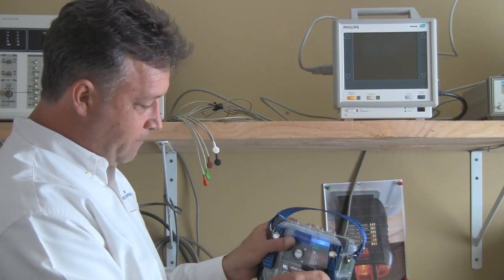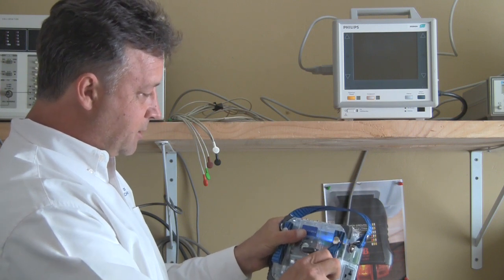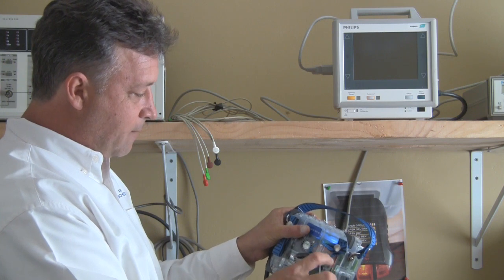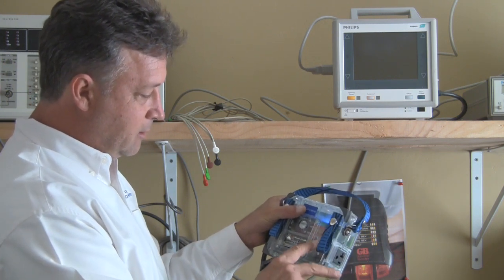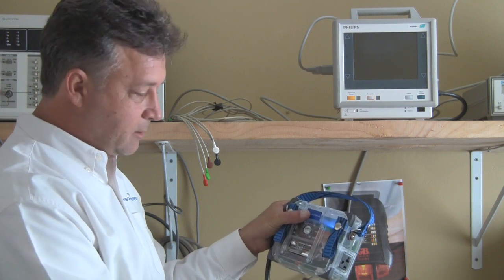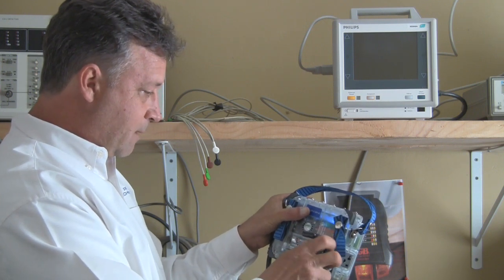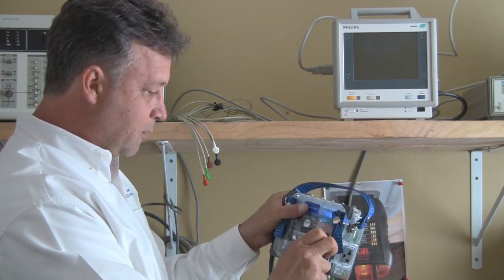We've incorporated a bracket assembly that allows you to clamp it to anything you need to, or you can take the clamp off. It's the standard camera size mount so you can use any clamp you like. We offer a couple different versions of a pole clamp that you can use with it.